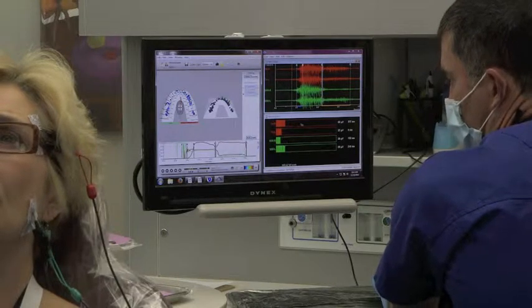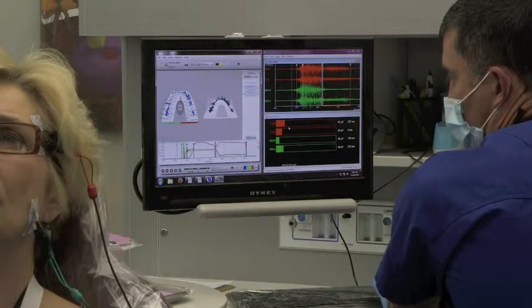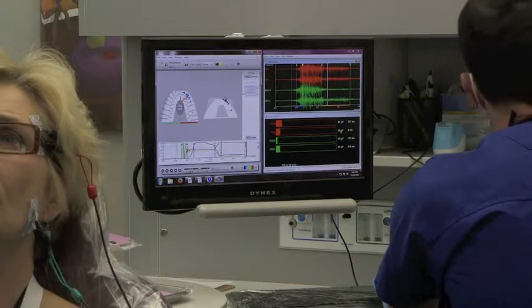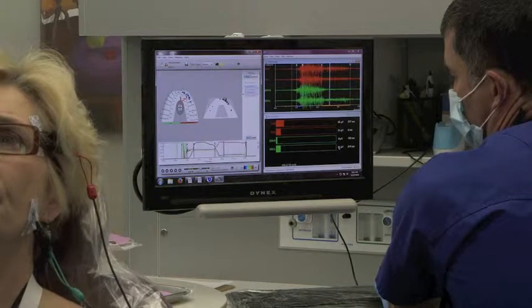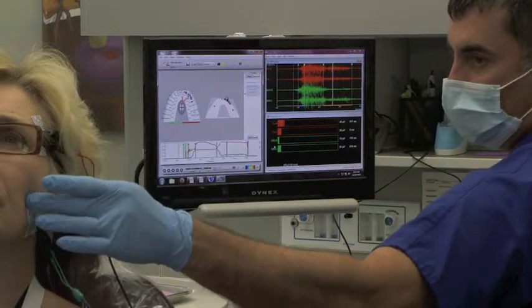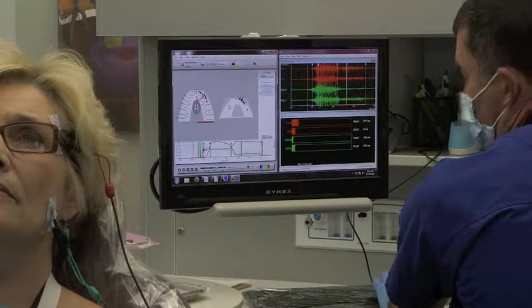Look at these numbers. Now, you're starting to stroke towards your right — so this one should fire above 10, these should be below 10. Going over time — look at these numbers, those are not below 10. Those are quite high. This one's starting to shut down, but this one's not. Why is this left masseter — your left clenching muscle right here — why is it hyperactive? At that moment in time, that little glitch right there is what's causing it.